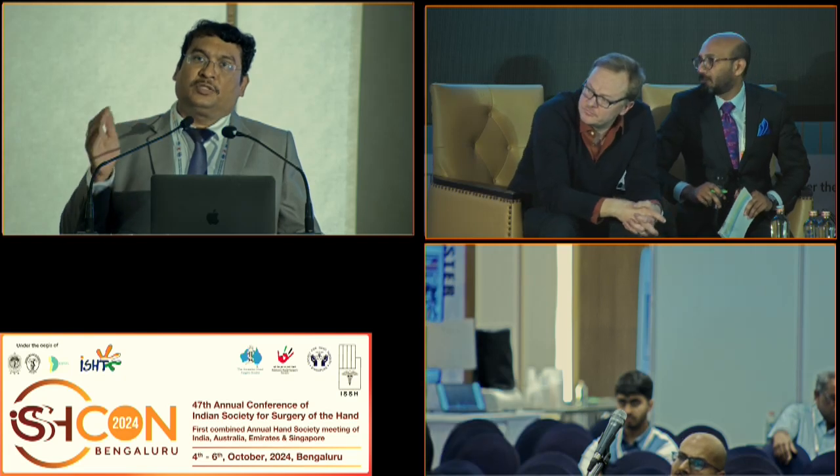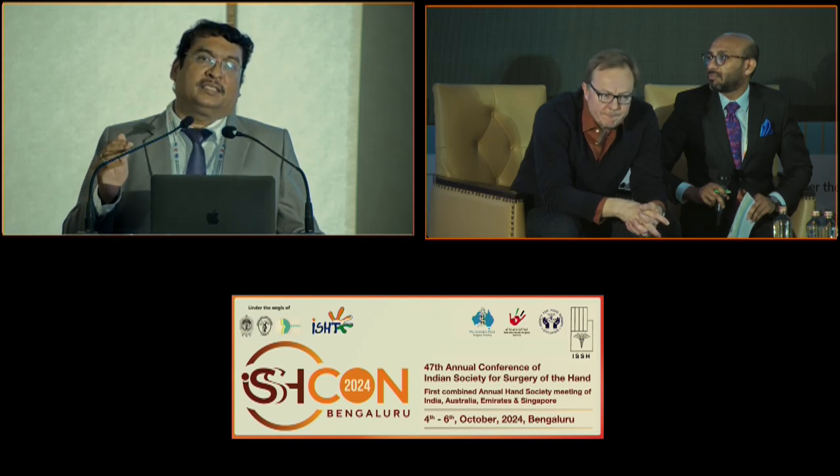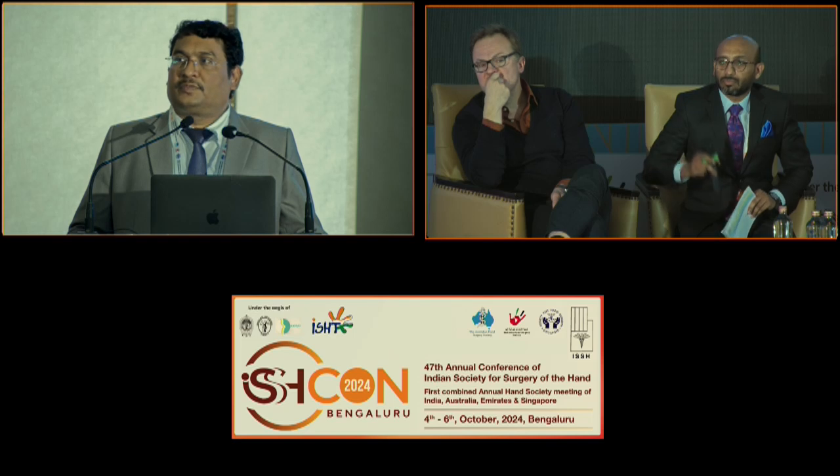Yeah, see, in this technique we are not only considering the dorsal ligament, the interosseous ligament is also very important. That's why, with the whole complex, if the remnant is present, it is going to give stability. If it is a very old one, then we have to do a 4-corner sort of thing. Can you add?